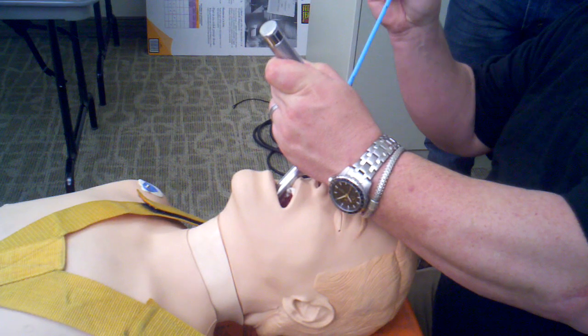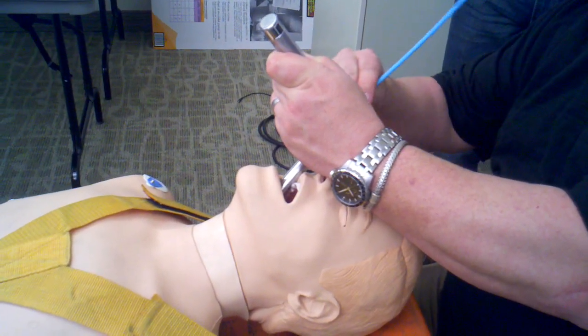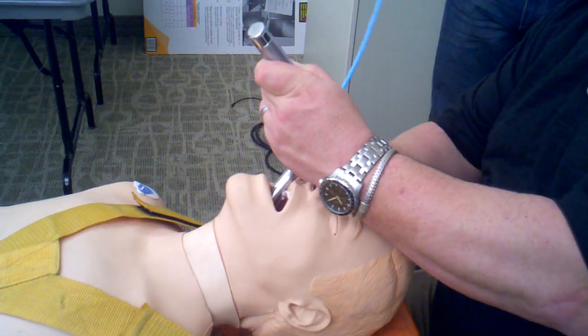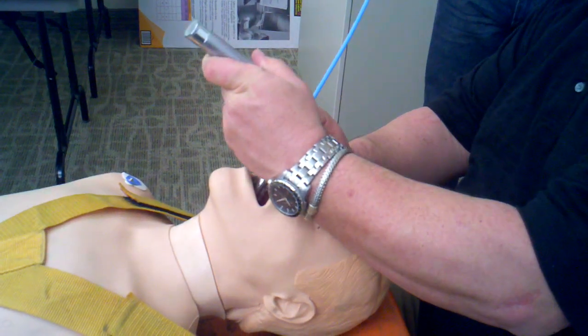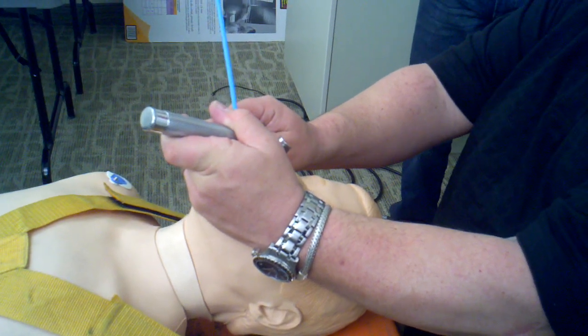We're going to take the coude tip of the bougie, slide it through the barrel, turning it to the right as it exits the tip of the blade and into the glottic opening. Then to complete the intubation, we're going to leave the Miller blade in place, sweeping as much of the tongue to the left as possible, loading the bougie and inserting the tube.